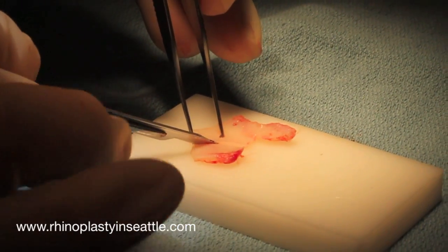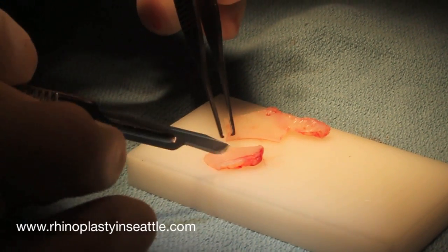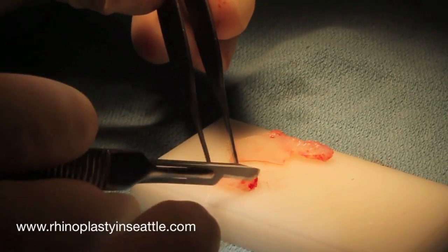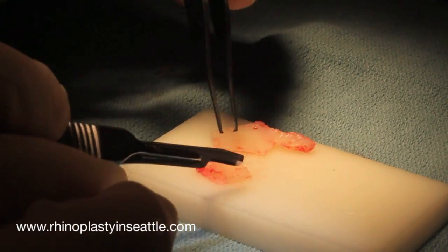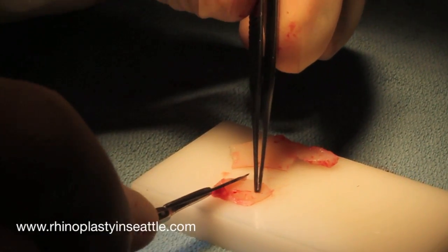The first step is to carve a piece of cartilage off of the harvested septal cartilage in this case. We'll first trim the rough size that we want and then begin to bevel the edges. The idea is to make sure there are no sharp edges, so that the graft is hidden quite well in the external nasal valve area.